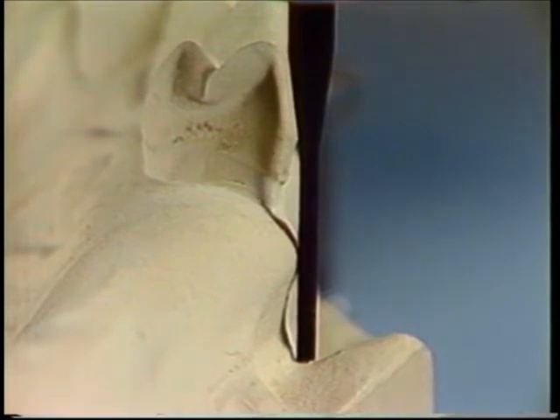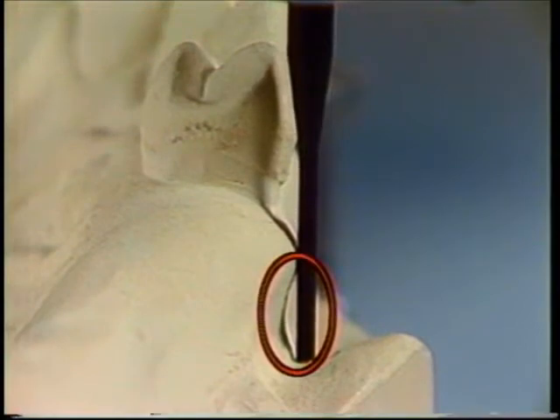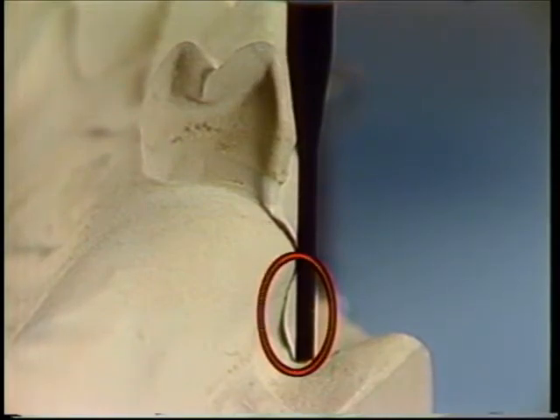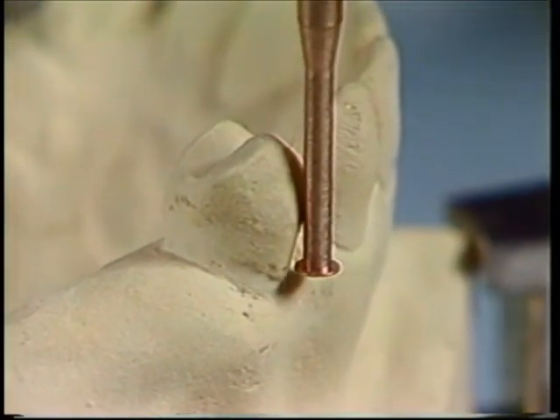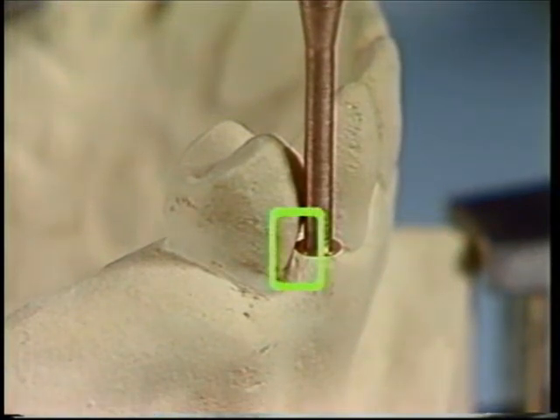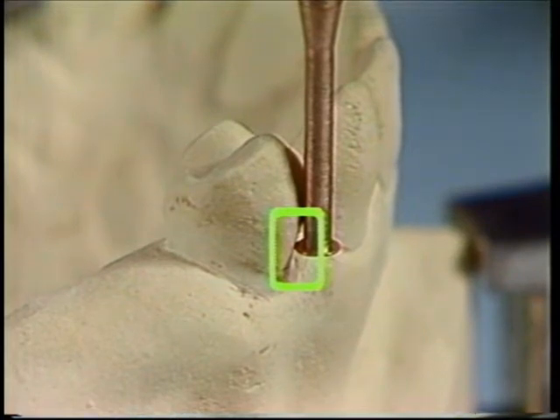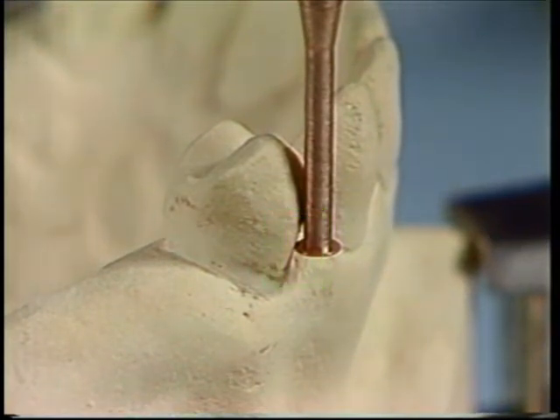The analyzing rod is also used to examine interferences to the path of placement. This particular buccal exostosis may interfere with the placement of the I-bar or a well-adapted base. The undercut is then measured with an undercut gauge. The shank is placed in contact with the tooth and raised until the nib touches the tooth. At this point, a 0.02 inch undercut exists relative to the height of contour.